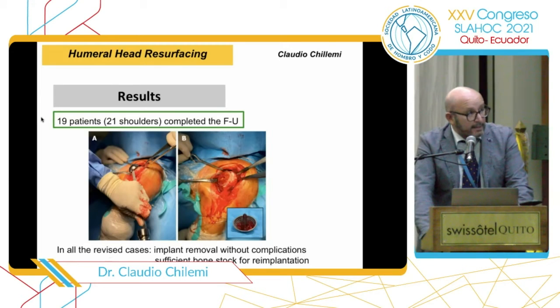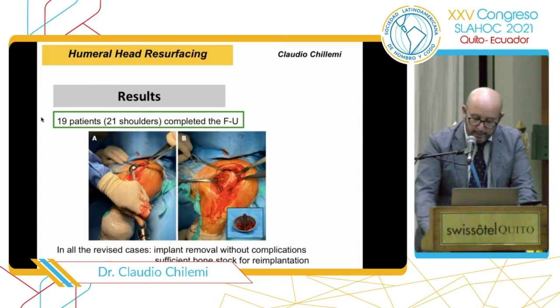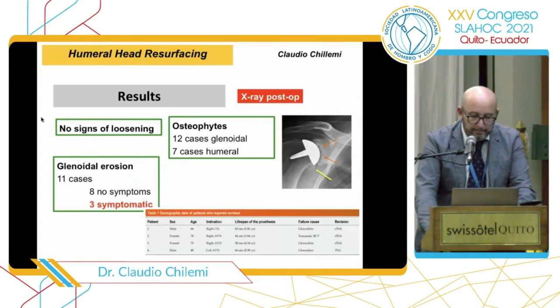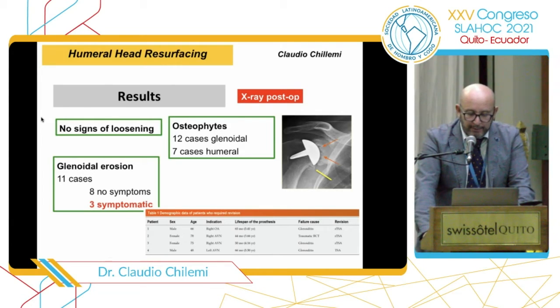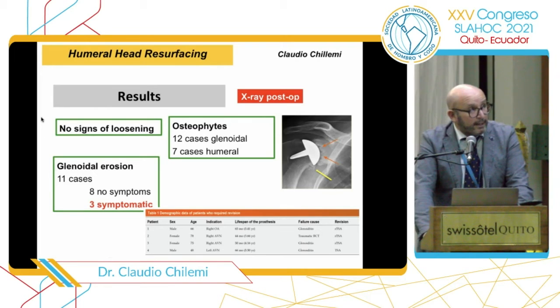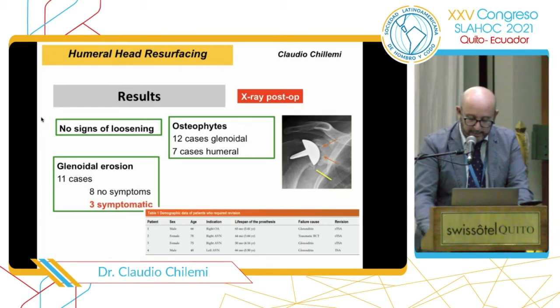In all the revised cases, the implant removal was performed without any complications, and as you see in the picture, there remains sufficient bone stock for the reimplantation. In 3 cases, we converted the implant to a reverse prosthesis. In 1 case, we implanted a total shoulder arthroplasty. If we have a look at the postoperative X-ray changes, we didn't find any signs of loosening, but we had the appearance of osteophytes in 12 cases on the glenoid side, and in 7 cases on the humeral one. And in 11 cases we had a glenoid erosion. In 8 cases it was asymptomatic. In 3 cases symptomatic, and then revised.